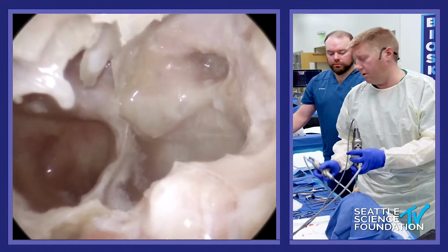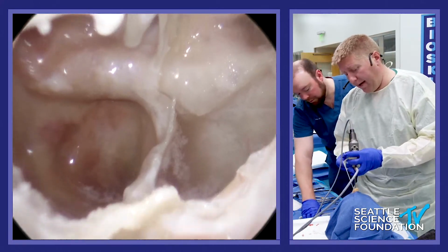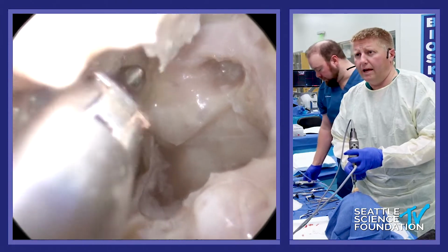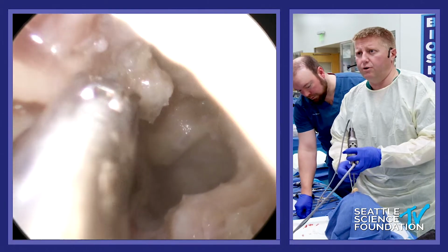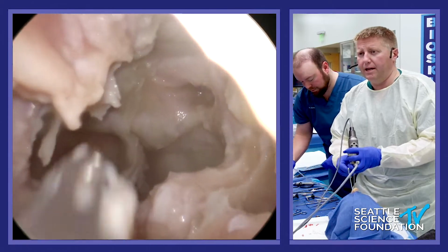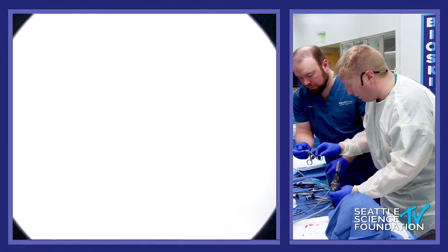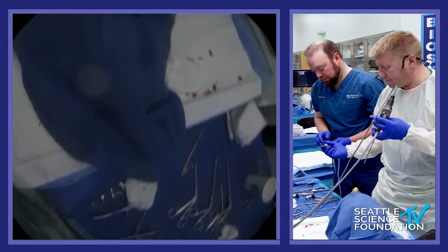Could I see a straight through cutter, please? I like a bipolar called the Aquamantis. It's actually a spine bipolar, and it's got a rounded tip on the end. And so you don't necessarily have to grasp something in between it. It almost has a suction bovie look at the end of it, but it is a bipolar. And so I'll bipole a lot of that mucosa just to prevent bleeding. I'll take that drill, please.